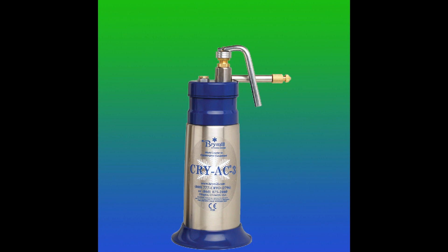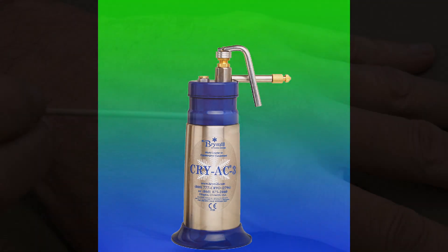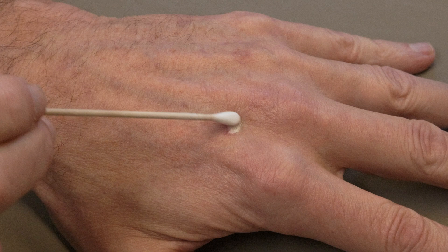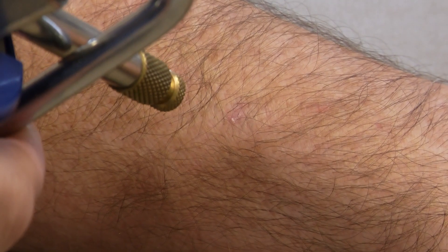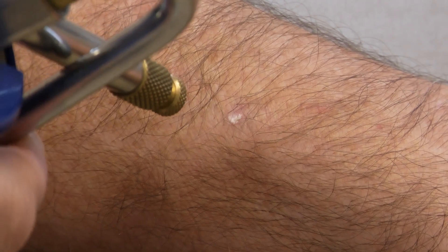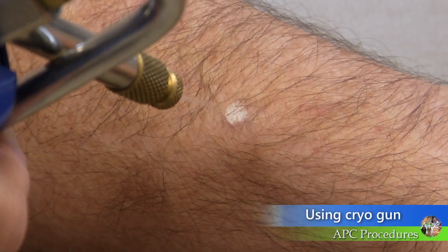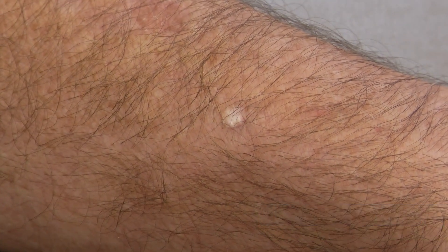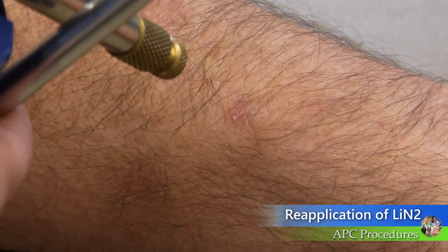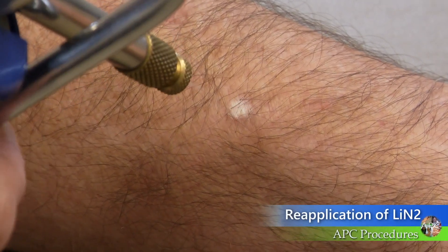Cryotherapy is performed using liquid nitrogen applied with a cryogun device or using a cotton tip swab. For cryogun application, hold the tip of the gun about five centimeters from the lesion and spray it in short bursts until the surface of the lesion turns white and remains frozen for three seconds. Stop the application and allow the lesion to thaw. The lesion should remain white while thawing for at least five seconds to allow for cell death of the superficial layer of skin.